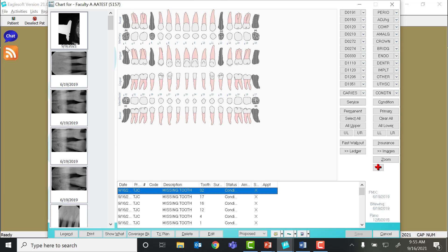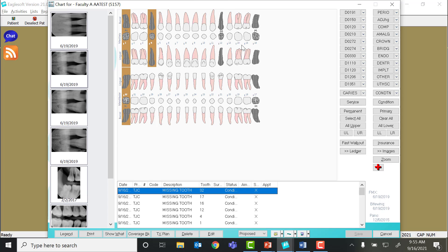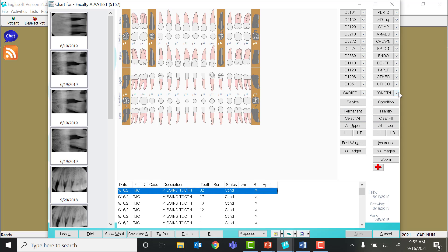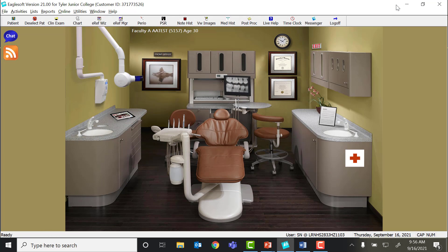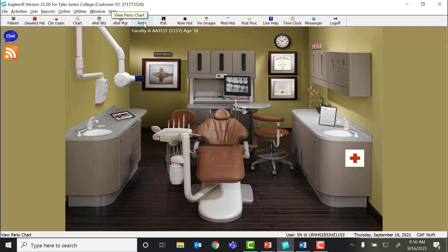I have already went in and removed these six teeth in the dental chart by highlighting the teeth, going down to the condition drop bar, and selecting missing tooth. Once that is done, you can X out of your dental chart. It will ask you if you want to save. You're going to click yes, and then you're ready to go to your perio chart.